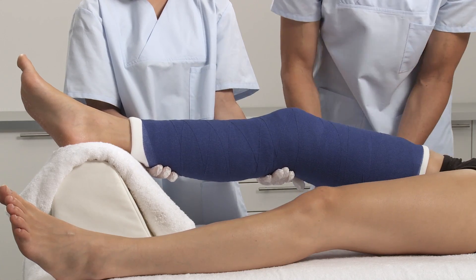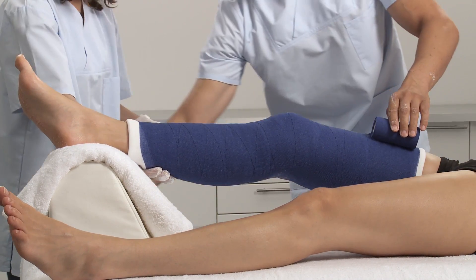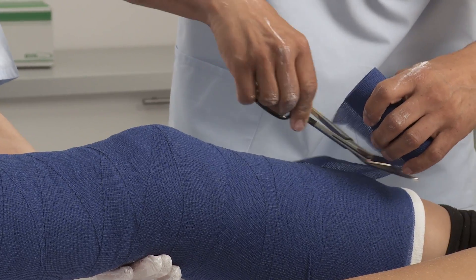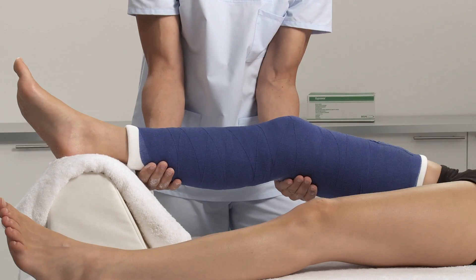Check for desired range of motion and any points that may cause irritation or pressure. After approximately 3 to 5 minutes the splint is set and the patient can be released. After 24 hours the splint is fully set.